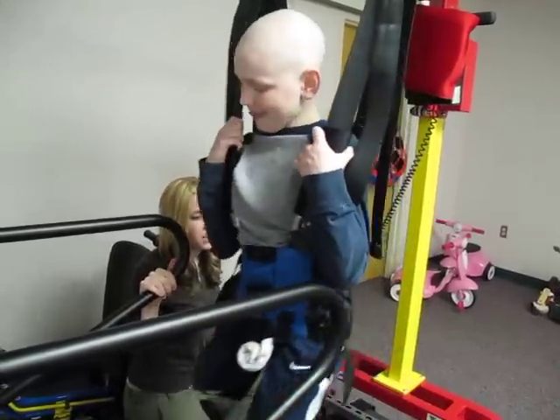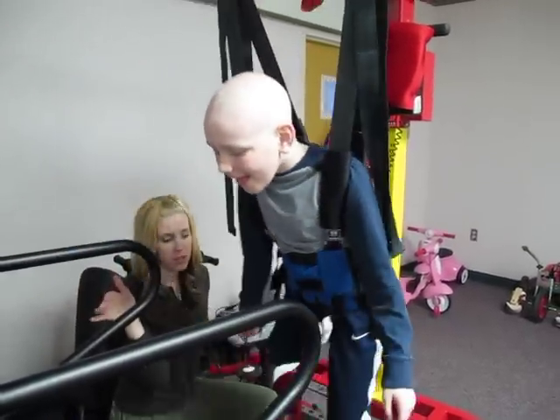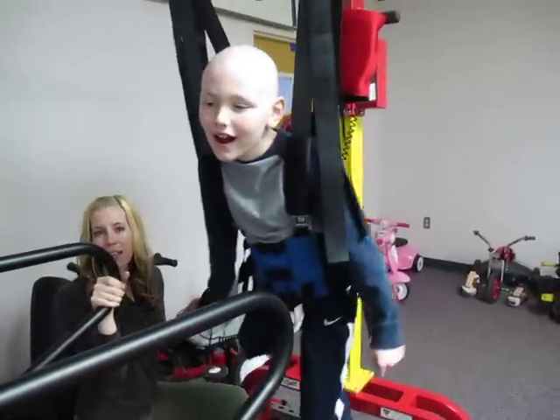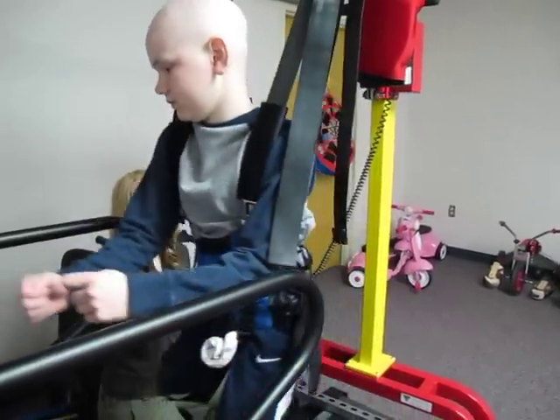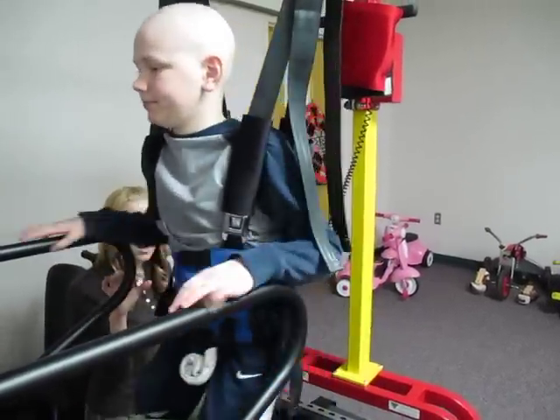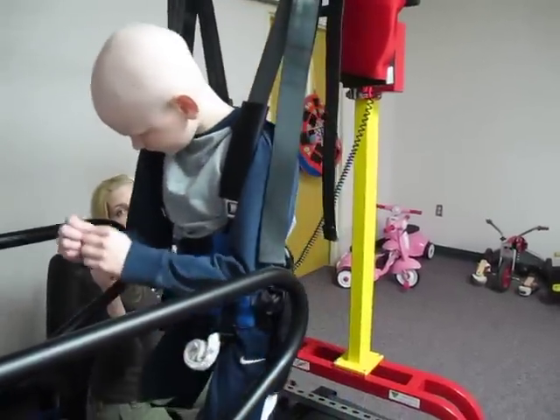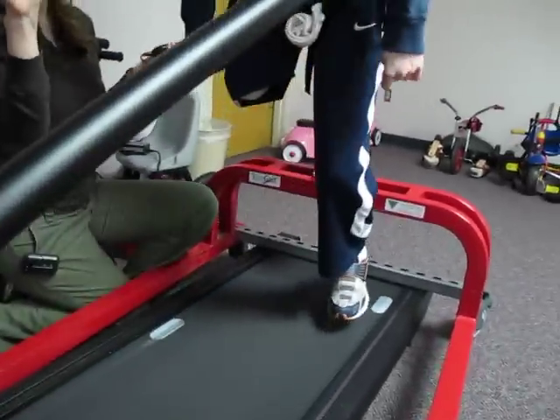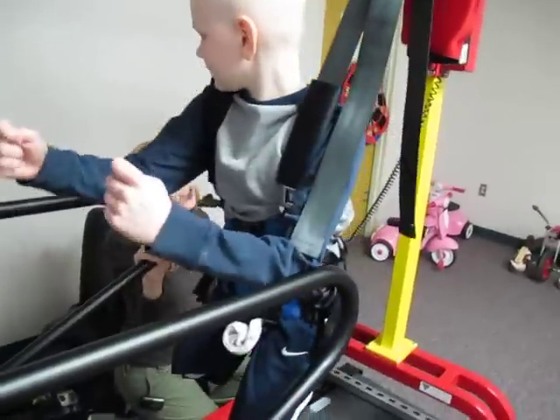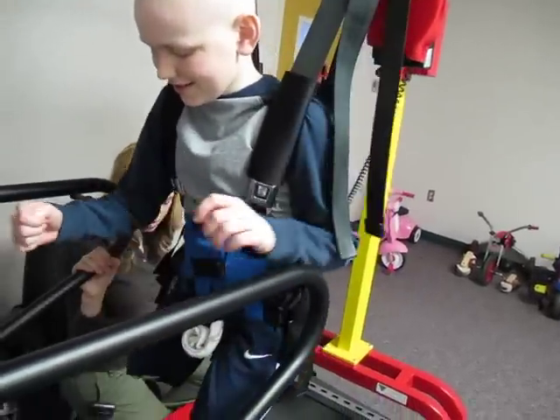You know what's cool too — when we're practicing, you can videotape it from each side. We can even move this out. Because a lot of times when we're working on walking, you'll do what's called a gait analysis. I'm sure he'll do something like this at Hanger too. As therapists we'll do it sometimes when we're learning different things about gait — you can slow down the video and really watch what's going on. So you guys could practice here and then go home and watch yourself and say, oh okay, now I need to try and make my foot do this. So you can even use it as homework. You can videotape it and then go home and show dad or your friends or whoever. So put your foot back down. There you go.